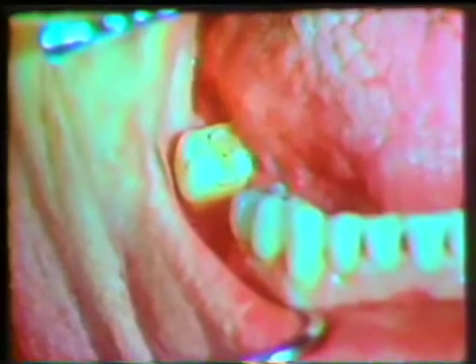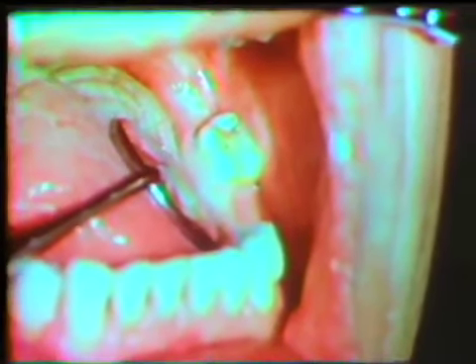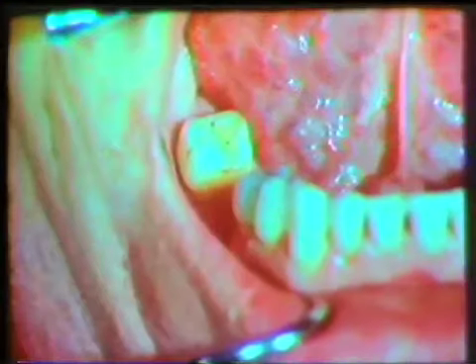The mandibular posterior rotational path partial denture can be demonstrated clinically on this patient. Notice the long occlusal rest preparations on both molar abutments. Both posterior abutment teeth are tipped slightly forward, and sufficient undercut exists on their mesial surfaces for adequate retention. When seating the partial denture, the molar rests are placed first, and then the premolar clasps are rotated into position.